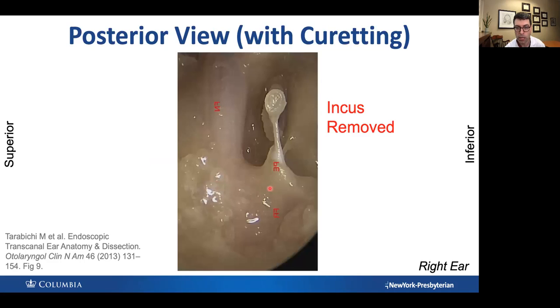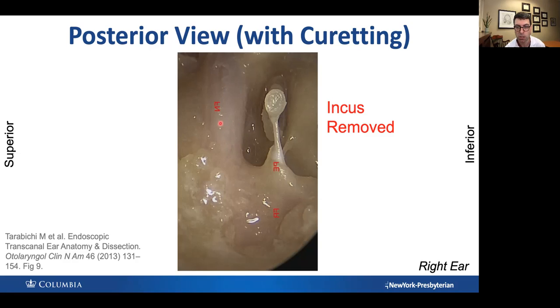This is a more posterior view gained with some curetting, and now the incus is removed. We see the stapes again, like a bird over it. You can see the capitulum and can make out the anterior crus and posterior crus. Here's the stapedius tendon, which comes from the pyramidal eminence. The facial nerve is very obvious — look how thick it is. You can't miss the facial nerve; it's thicker than the stapes. And then posteriorly, you can see basically what would become the facial recess if you had drilled it through a mastoidectomy.